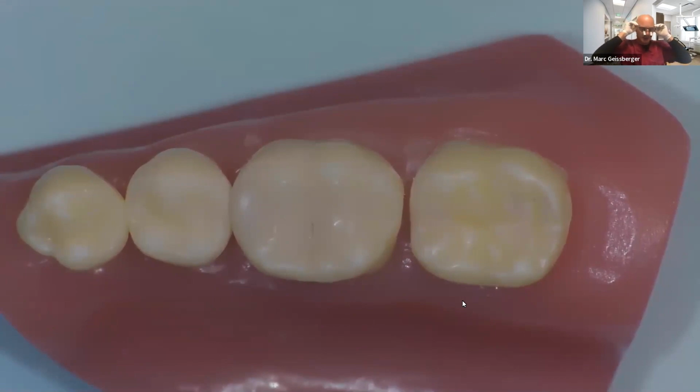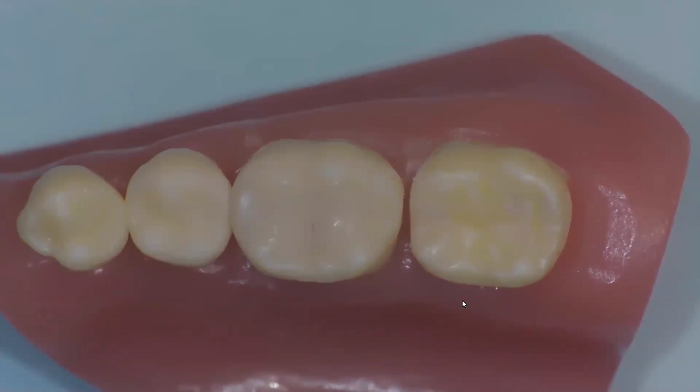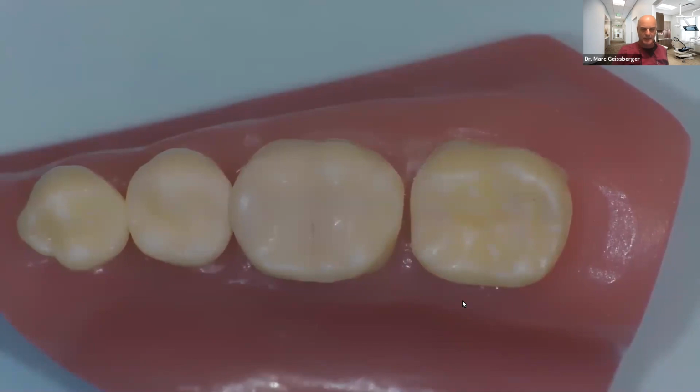So keep going, Grant. All right. Our next question reads, any concerns about the shrinkage of the flowable in the proximal box? You know, that's a great question. And there have been about 6 different studies that looked at the performance of a flowable compared to a conventional composite, and actually showed, oddly enough, that even though flowables do shrink some, there was less microleakage at the cervical when you compare a flowable to a conventional composite alone. So I have no concerns, and I've been using flowable in the box form for about 12 years with super high clinical results. Great, thank you.